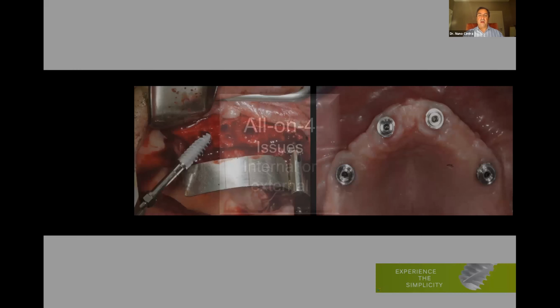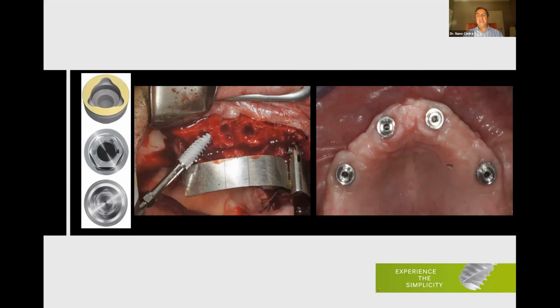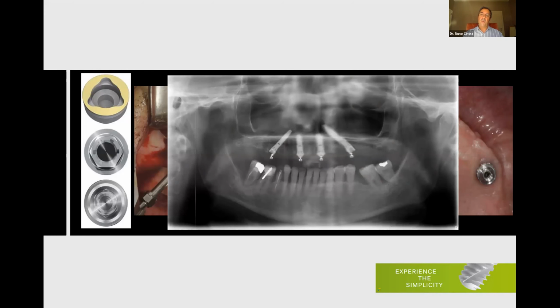Internal, external, well, I've tried all, it's up to you. I've tried trilobe, I've tried internal X, external X. Nowadays I'm using more internal X. What I don't recommend is the trilobe, because as you know, with the trilobe we have to leave one of that triangle pointing towards the external aspect of the bone. So it's the implant that decides where to stay, and that's not all right. I prefer to be the one to decide where to leave the implant. I like to leave the implant where I find good stability, good primary anchorage. And good primary anchorage for me is between 45, 50 newtons. Above 50 newtons, that's the best to load the implant.